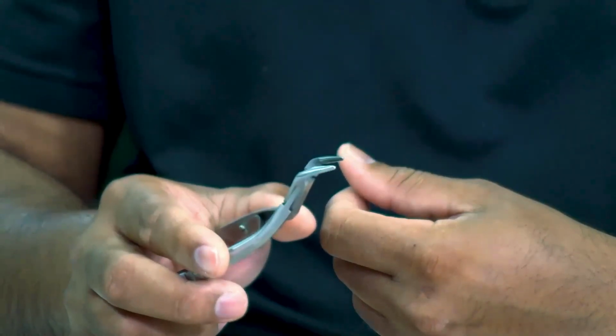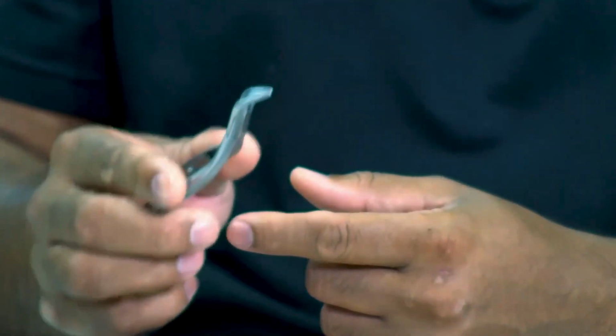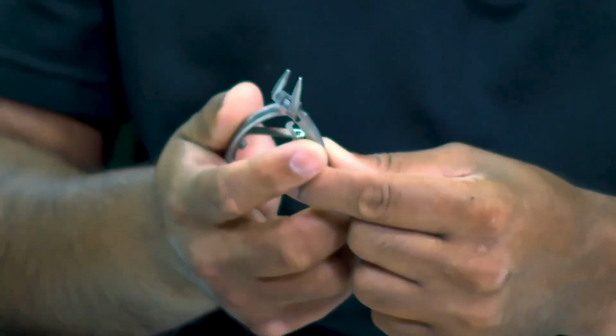I also use this a lot to clean out granulation tissue and remnants of flap and not so nice tissue. So that's why I really want to have the mini end of this, because it works quite well in that situation. So I'm not using this like a traditional rongeur where we're using it to cut big pieces of bone, but we're using it to cut small little areas of bone where we need things a little bit smoother, but mainly to get granulation tissue out and to be able to grab small parts and pieces of tooth fragments in the mouth as well.